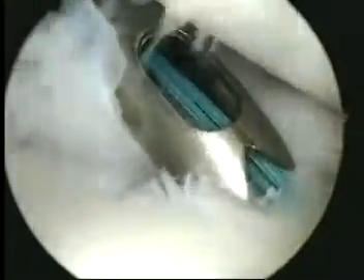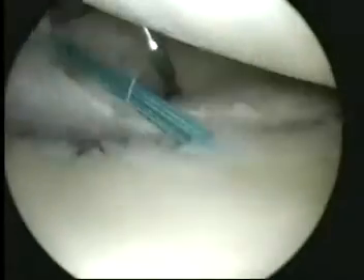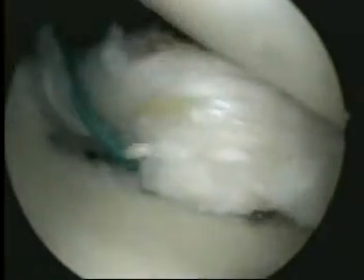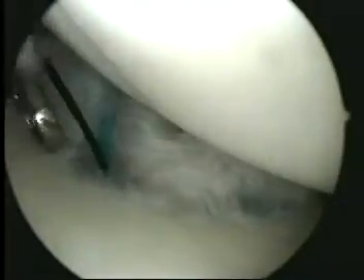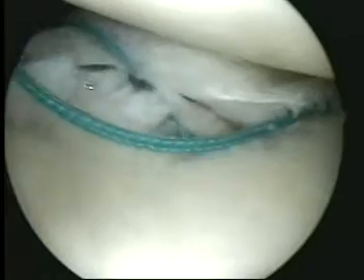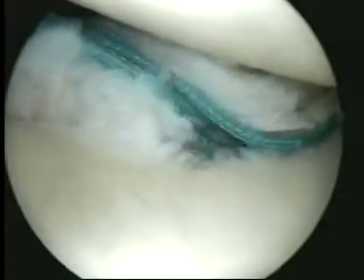There are several techniques for retrograding the suture through the tissue. One is the suture shuttle technique. The shuttle is inserted much like the direct PDS technique. The free end of the shuttle is retrieved out through the cannula. One limb of the anchor suture is threaded through the suture shuttle, and the shuttle is pulled back through the tissue.